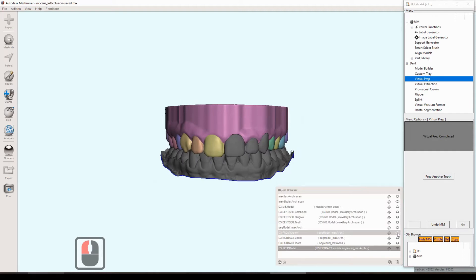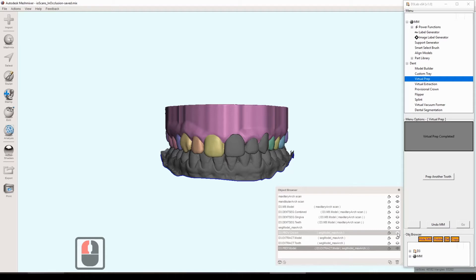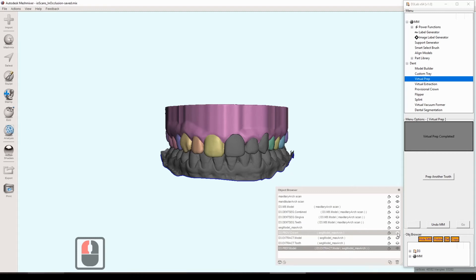But if you put the provisional over it like I just did, it looks great. It has the exact same, it's all based off of the original scan data. All the external components of everything that was generated is based off the original scan data. So it's super accurate. And it just looks good. So that's the virtual extraction tool, virtual prep, and the provisional.